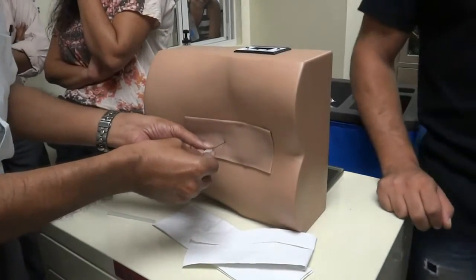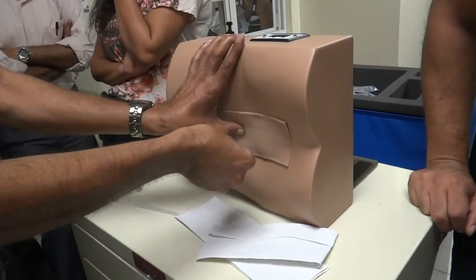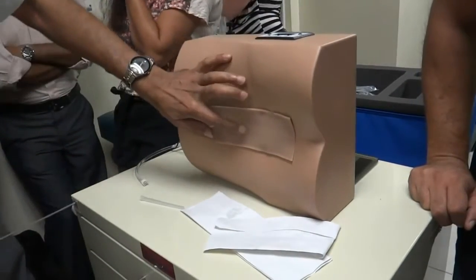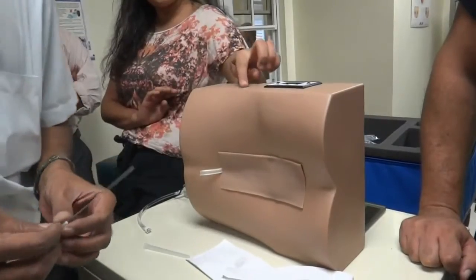You have to reinsert the stilette. And with a little counter pressure here, just pull the thing straight back. Then we put a tincture benzoin seal or autologous blood graft here. Send the patient. Put the patient flat for 24 hours.